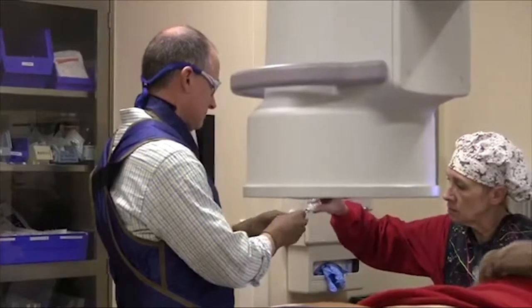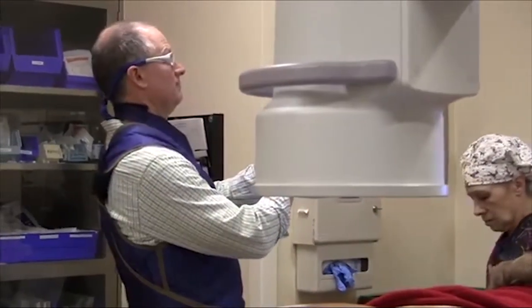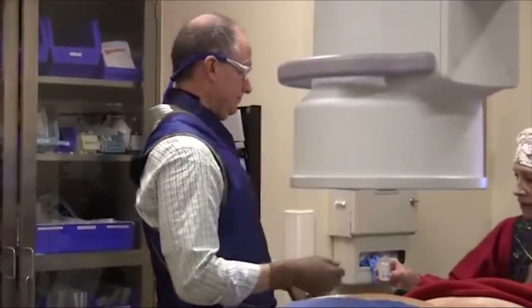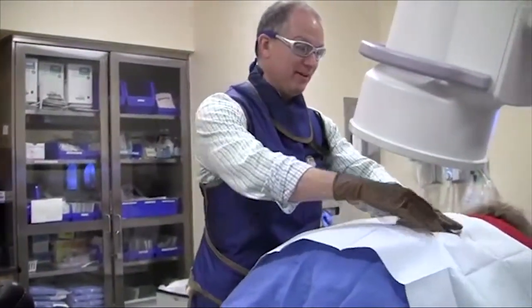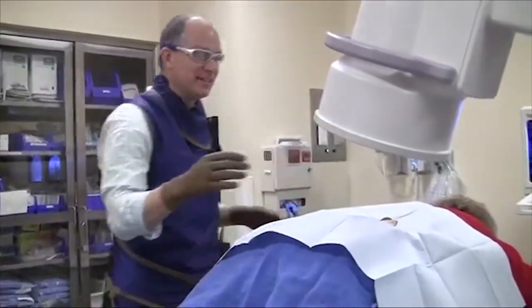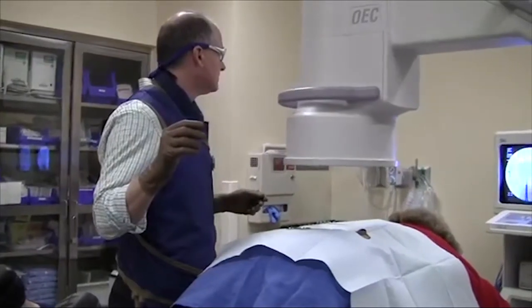Prior to beginning the procedure, medication is drawn up. This medication is specific for the type of procedure that is being performed. The patient is then prepped in a sterile fashion and a surgical drape is placed over the side of the injection.